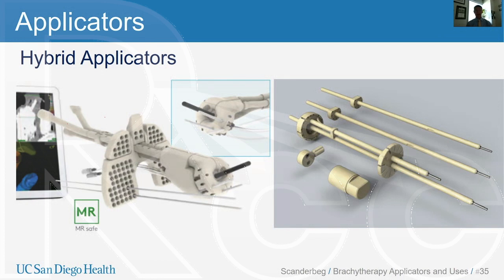On this slide, we can see an Elekta applicator on the left that's a tandem and ring applicator with holes for needles that pass through the ring, and it also has an additional attachment proximal to the ring that guides those additional peripheral needles. On the right is a Varian applicator that's also a tandem and ring with needle holes in the ring, usually referred to as a Vienna style ring for supplementation applicators, so adding needles to extend that dose lateral to the ring.